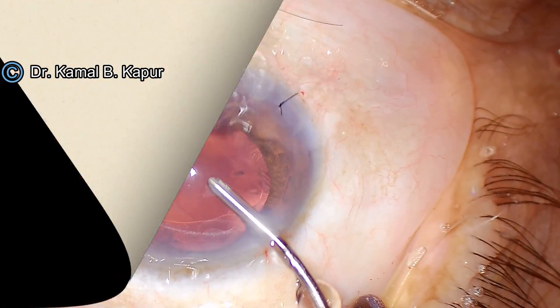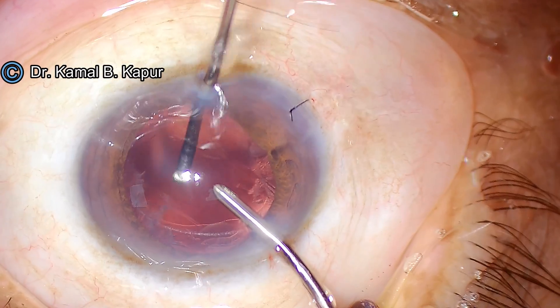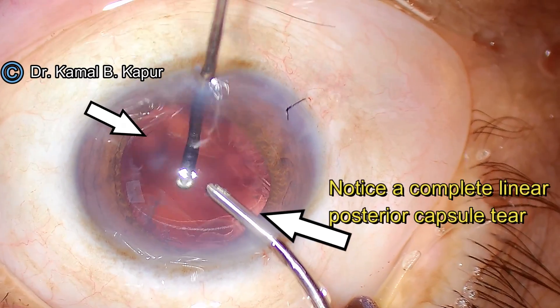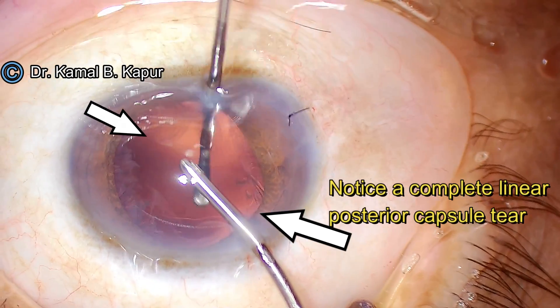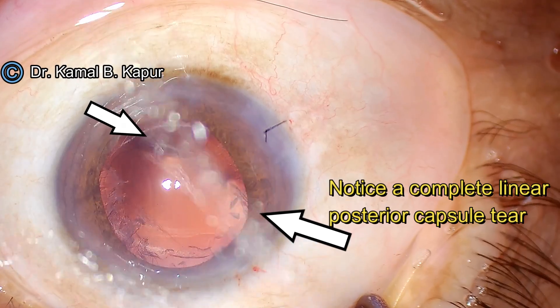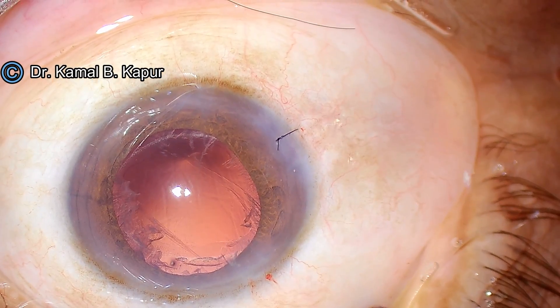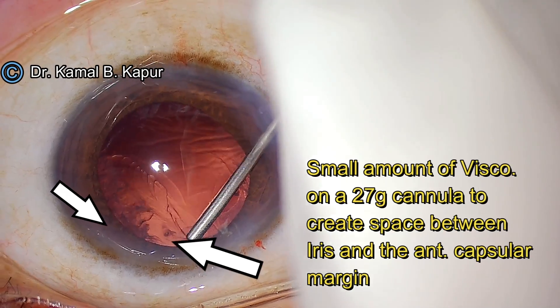Always remember never to do anterior vitrectomy without putting a suture on the main wound. Having done the anterior vitrectomy, there are a few things to be very careful about: we should not nibble on the already very long posterior capsular linear tear.